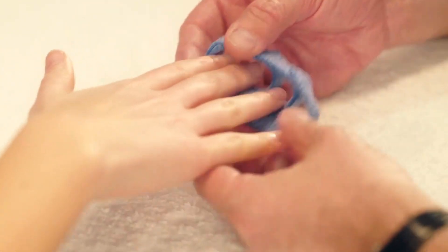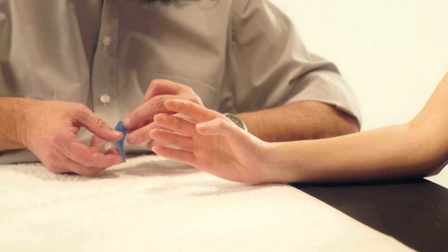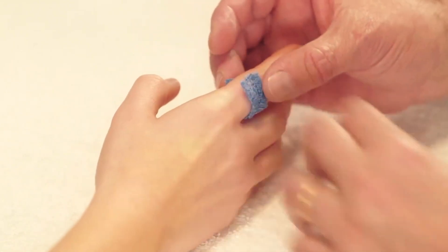Step 3. Take the last small strip of Orphicast and fold it in half. Mould it around the index finger.